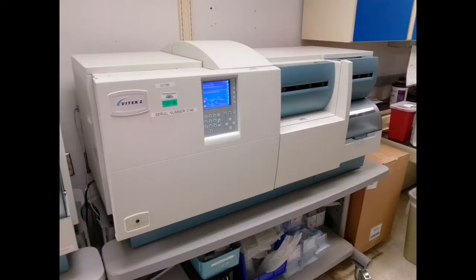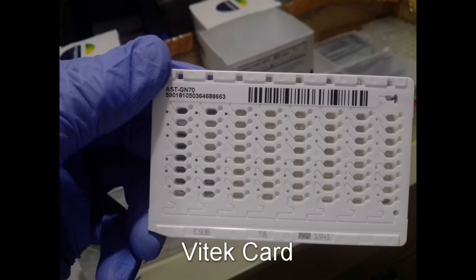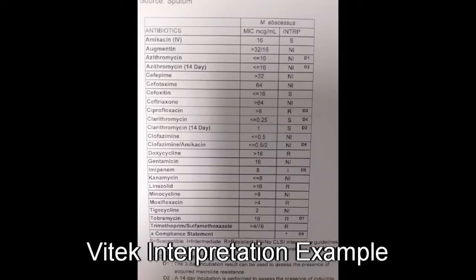And lastly, the most common method that we have in the lab is something called a Vitek. So that's an automated method to do it. And that works based on a turbidimetric method, or checking the turbidity. So pretty much you have your McFarland standard of your bug of interest, and then you have either a gram-positive or gram-negative sensitivity card that you have to put on the Vitek machine. And your bug, depending on whether it's gram-positive or gram-negative, will get that interpretation with the appropriate card based on the turbidity. Obviously, if there's more turbidity, then the drug is not effective, and vice versa.